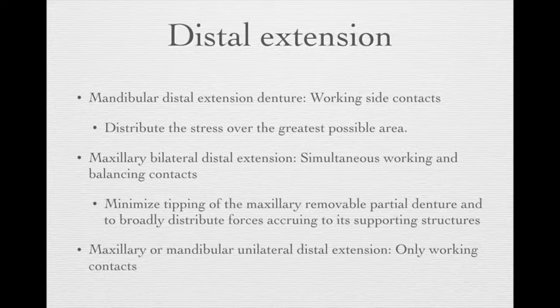When we deal with maxillary bilateral distal extensions, we are more likely to have simultaneous working and balanced contact, meaning a full balanced occlusion, because we can minimize tipping of the maxillary RPD and broadly distribute the force to the supporting structures.